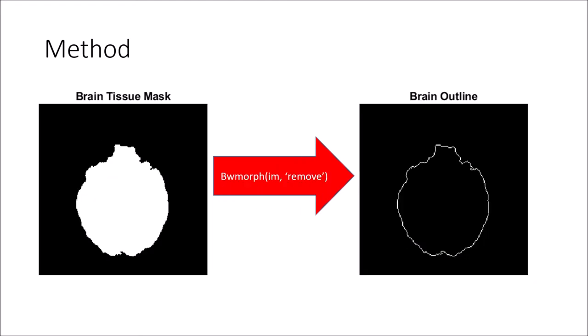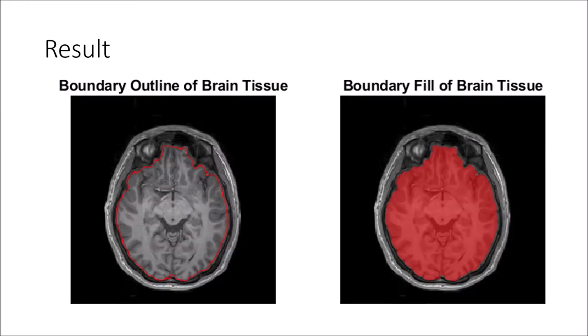Using MATLAB's binary morphology function, we keep only the outlying boundary of pixels. Here is the result overlaid with the original scan.